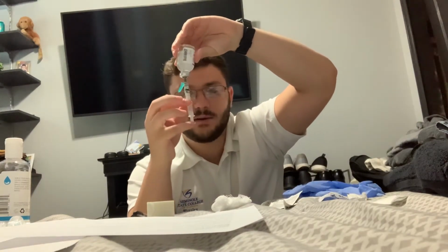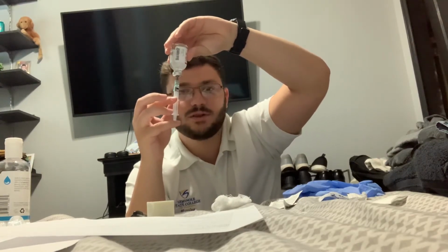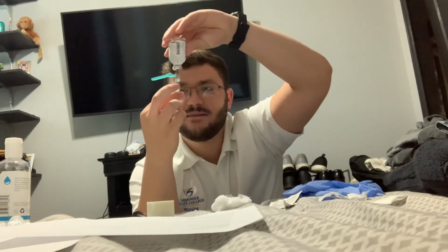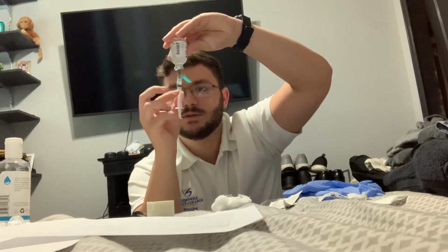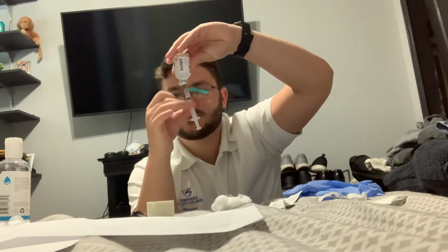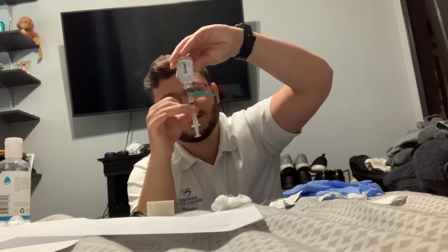That will create a septic syringe. So with using aseptic technique, I'm just going to touch the end and draw 0.5 mLs or more of the medication. The reason I can do a little more is because I want to ensure that I do not have any bubbles. If you do have bubbles, you're going to want to flick that. Flick it to the top.